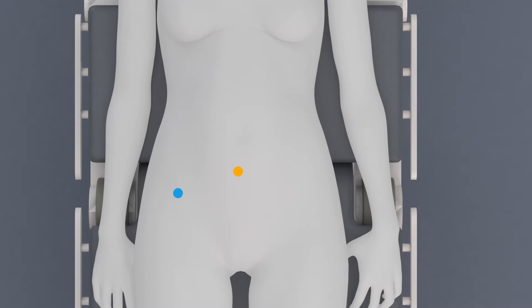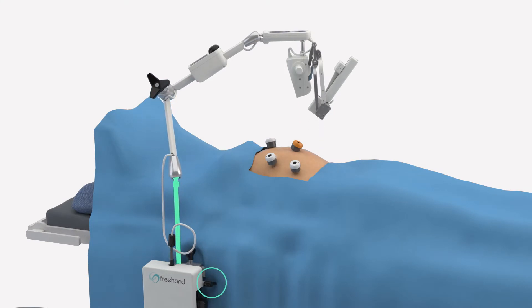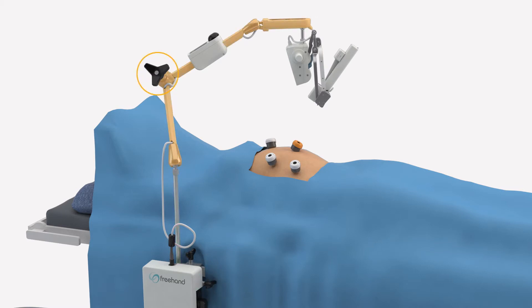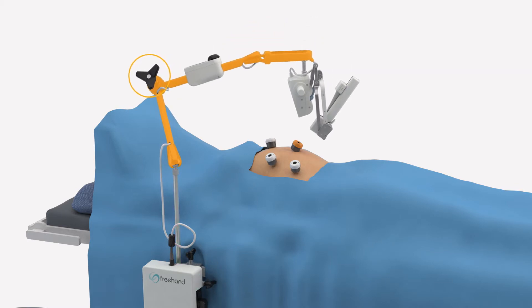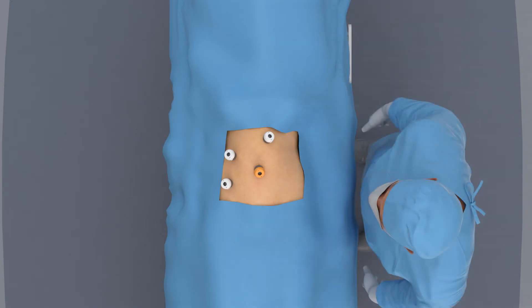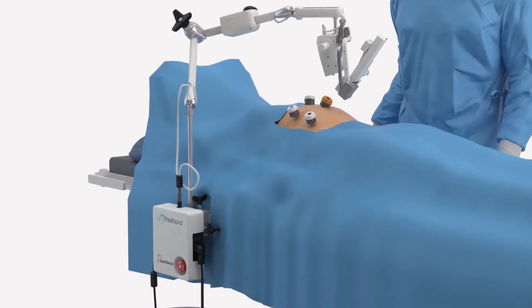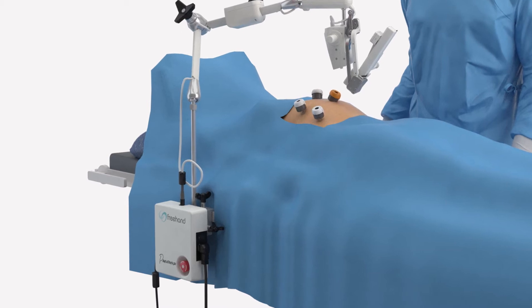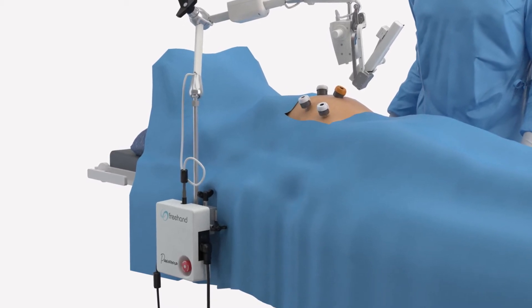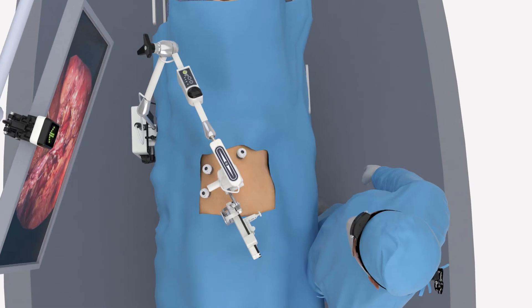The surgeon decides where the required trocars for the surgical instruments are best placed. The freehand arm height and angulation can be adjusted to avoid clashes between the arm and the instruments. The surgeon identifies where to stand. The monitor is positioned opposite the surgeon. The control box is positioned where it will not interfere with either patient care or the surgical procedure, with the arm typically opposite the surgeon. The last part of the freehand arm is pointing along the chosen midline, providing the optimal range of vision to the surgeon.